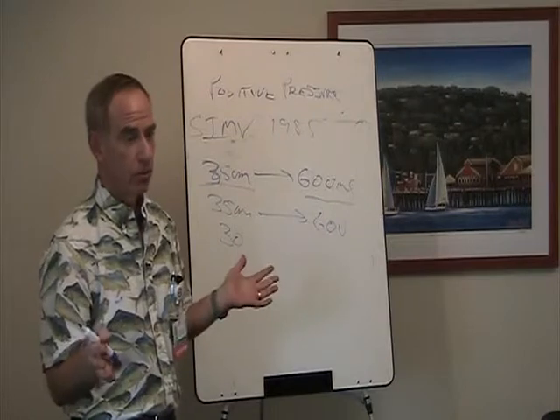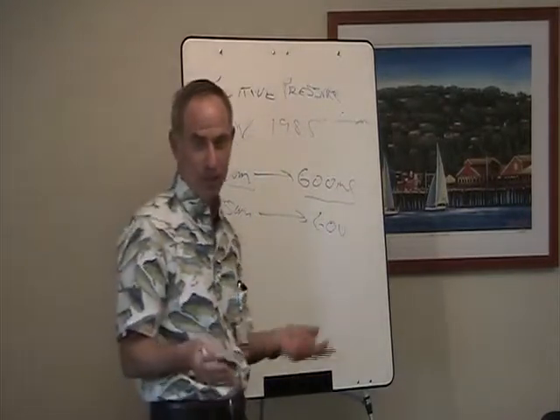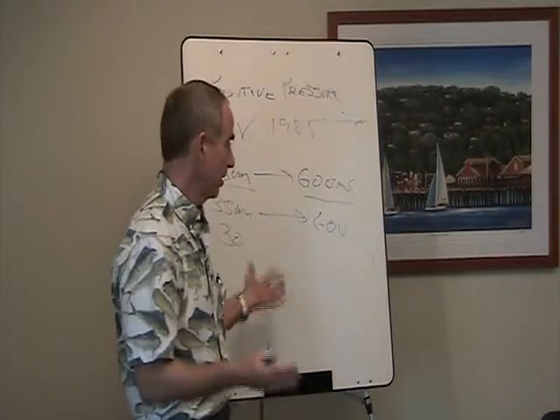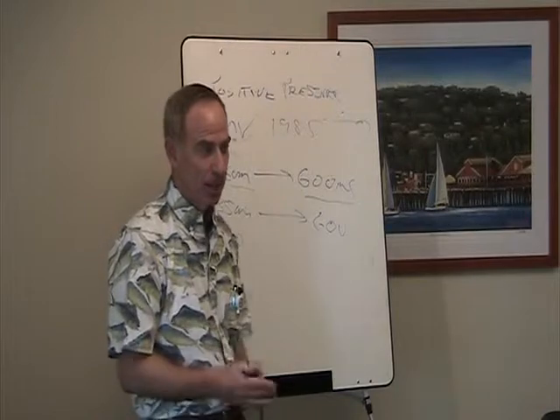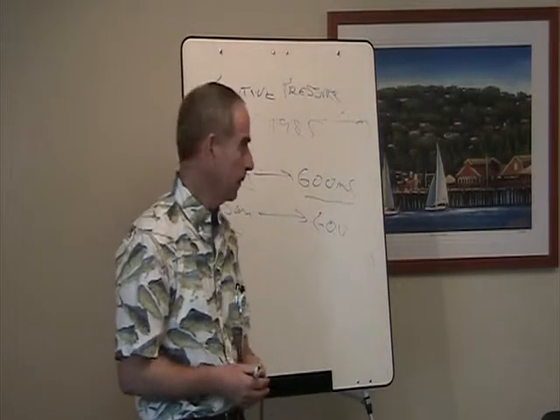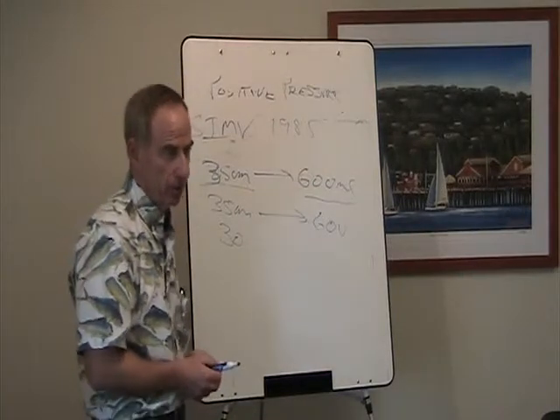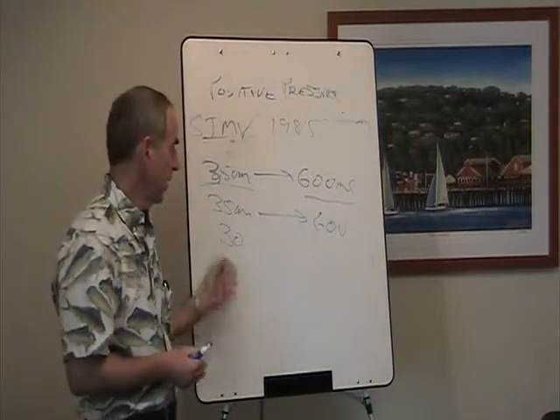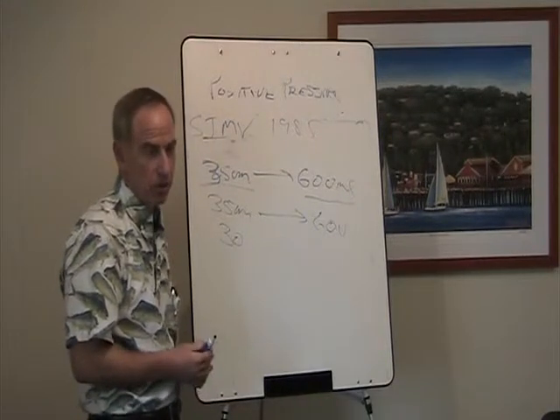So in pressure control ventilation, you can oftentimes ventilate people with lower pressures and generate the same volume, which is counterintuitive, right? It just doesn't go along with the physics that we've been taught, because the PV, the pressure volume product, should be constant. But it's the flow characteristics that make it different. So you can get by with a lower pressure a lot of times. So that's one advantage of using pressure control.